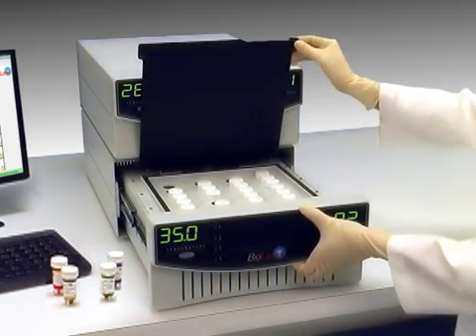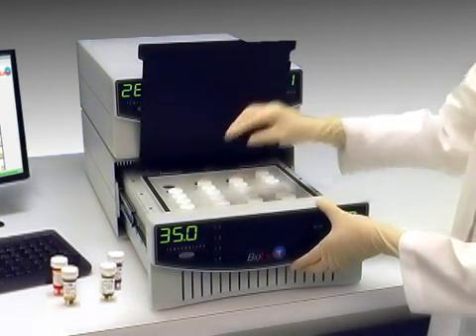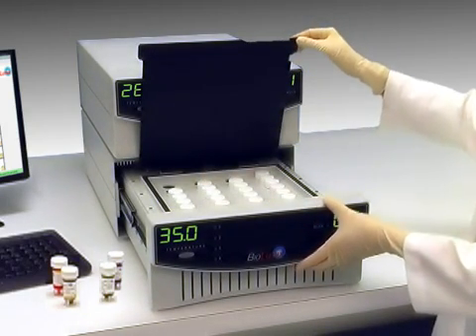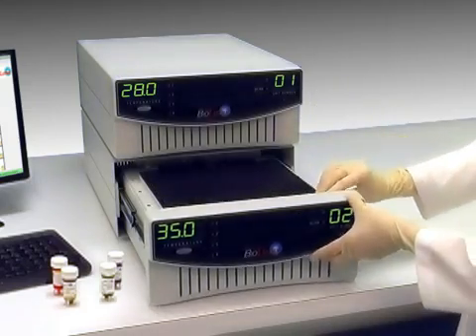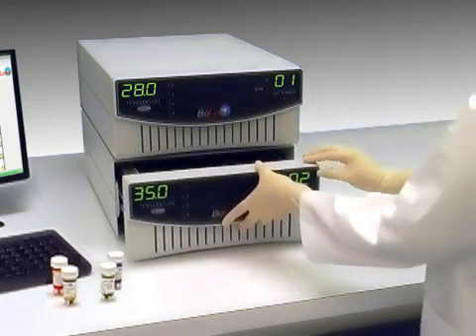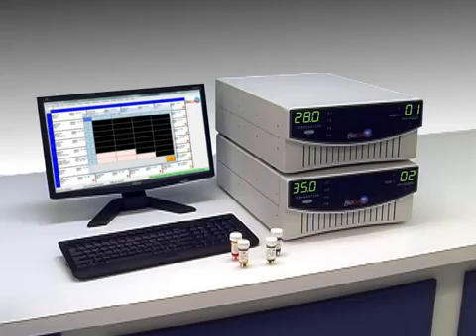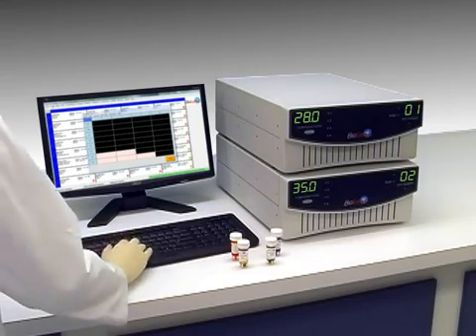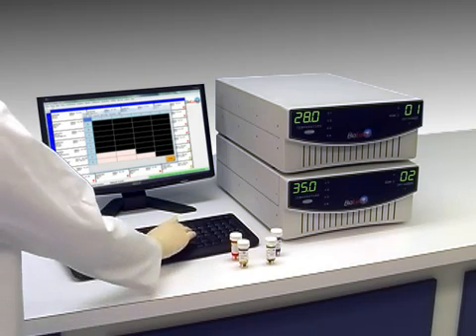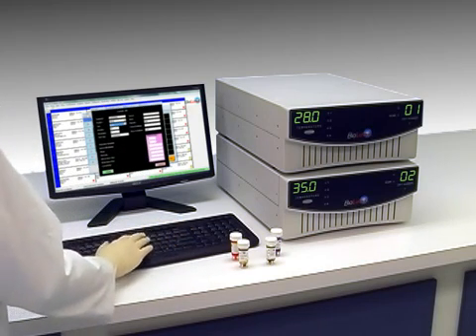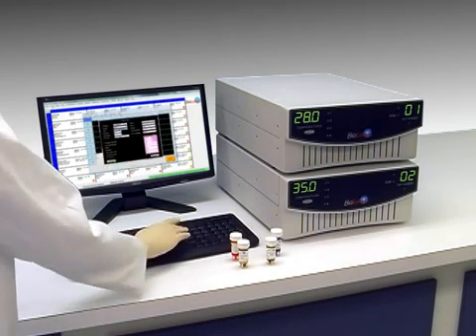Insert the vial into the instrument, then simply enter the information into the computer.